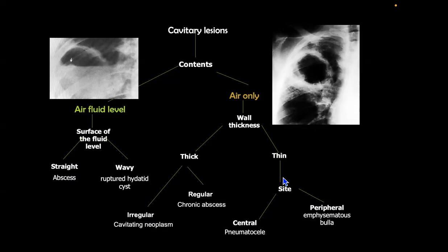Things might go in different directions because, as I said, I saw a patient yesterday with intestinal obstruction, and they were preparing him for surgery, and they did a CT scan for him. It was just a CT abdomen, but as we know, in CT abdomen we scan the lower chest.